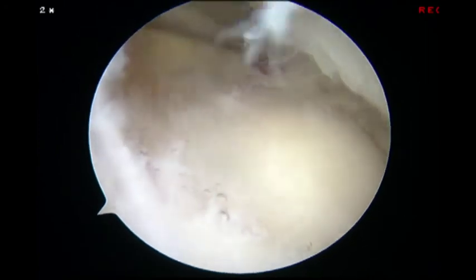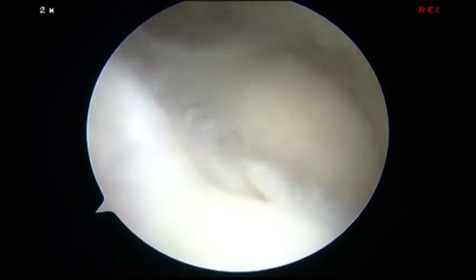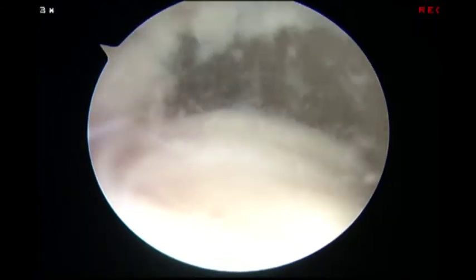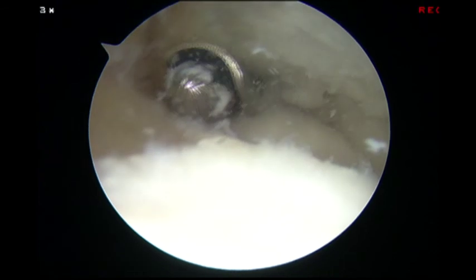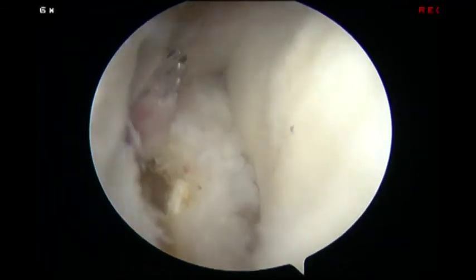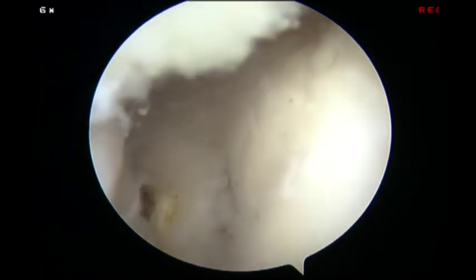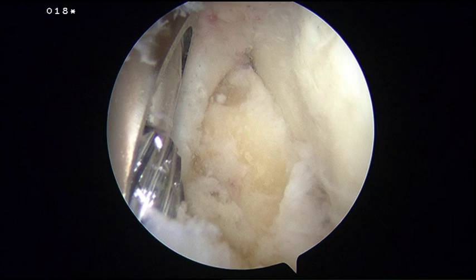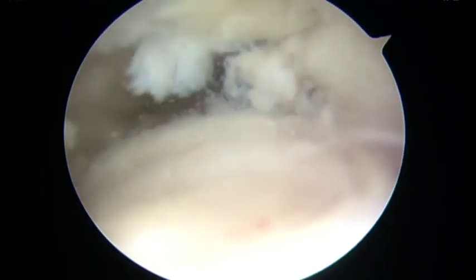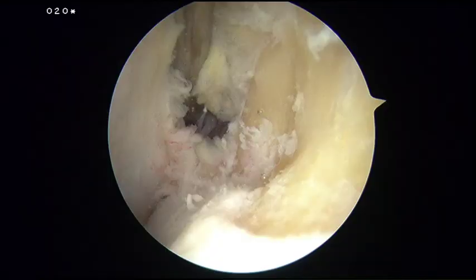Initially, the coronoid fossa was debrided of osteophytes and overlying fibrous tissue. Subsequently, the area around the radial head was debrided of osteophytes while being careful not to damage articular cartilage. A burr was introduced to abrade remaining sclerotic osteophytes and reveal the native coronoid. A burr and shaver were alternately used to reestablish the contour of the coronoid tip.